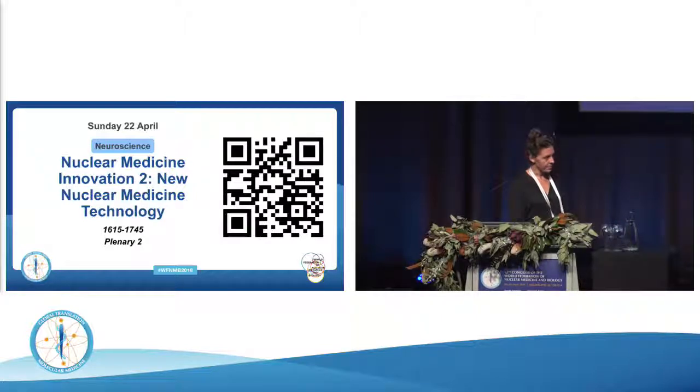I'm a PET guy, but I'm curious about SPECT. So from what you demonstrated, the abilities we have to do quantitative SPECT, has it already made a clinical impact? I think it's maybe too early to tell. Yes, it is a work in progress. I guess it depends what scenario you're thinking of. Dosimetry, for example: the quantification of the SPECT is really essential to that. As you're aware, there is a big push now for dosimetry on all the patients that are having treatment. So I think that will be one of the big drivers behind it, whether it be dosimetry on post-treatment imaging or treatment planning from our theranostic pairing agents if it's not a PET agent. I think that might be the first area where we see it really make a big impact.